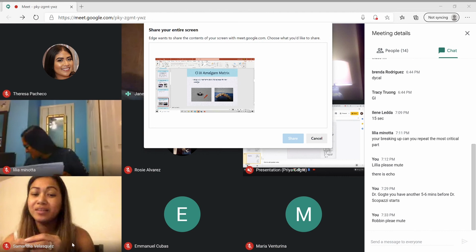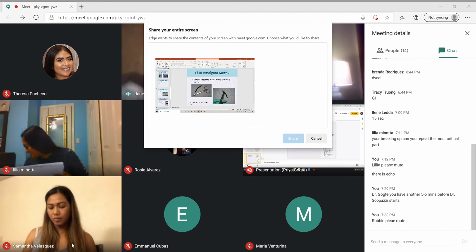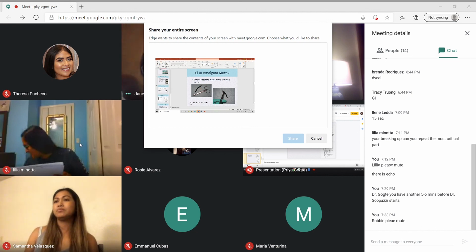The preparation itself I'm going to go over tomorrow, and I'm not going to go over it today. But the margins: you do not bevel the enamel. The enamel is going to come out of the preparation at 90 degrees. You have to make sure that you overfill, just like we've said so many times. Overfill, pack, and then carve, and you carve mostly with an Explorer.